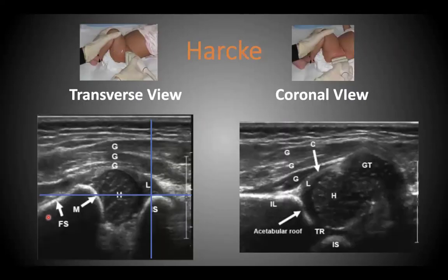So before we proceed with treatment, are there any questions? Bhushan sir, could you please explain that when the alpha angle comes in the 2C group, how do we correlate it with the beta angle? Could you just explain that again? Okay, yeah.